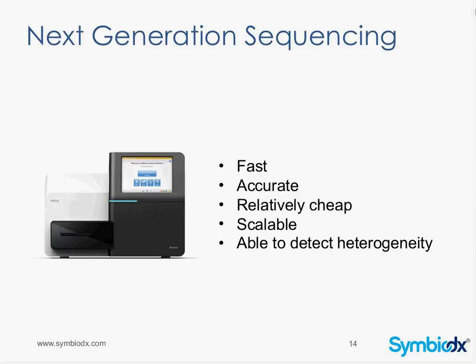When we're looking at tumor samples, this is particularly important because usually our sample isn't going to be 100% pure, for one thing. We may have 50% tumor content. And the thing is, we know that solid tumors are heterogeneous. In other words, there may be a minor clone that has a very important mutation, such as a KRAS mutation or an EGFR mutation. So we need to be able to detect this.